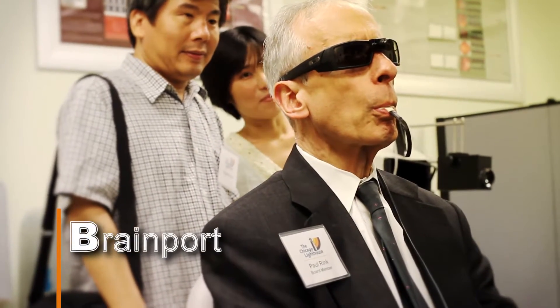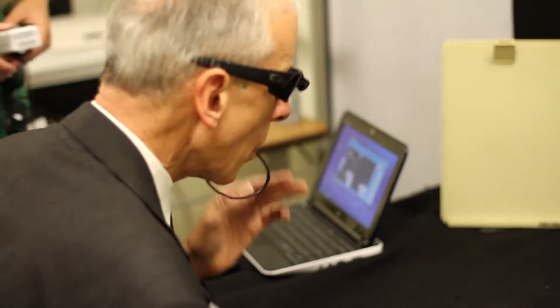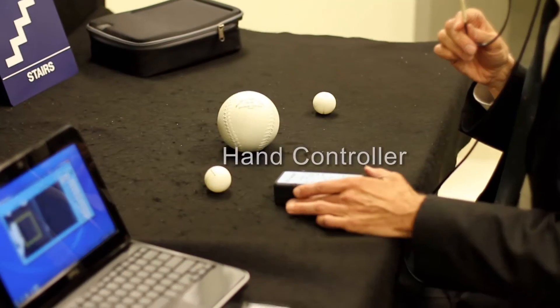This is the BrainPort V100. The camera is over the nose bridge on a pair of Oakley sunglasses, and it captures the environment in front of the user. That information is transmitted down a wire to a handheld controller.